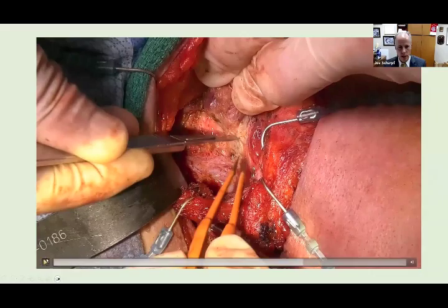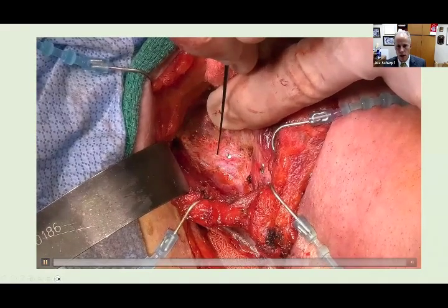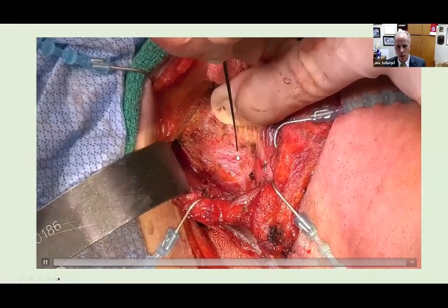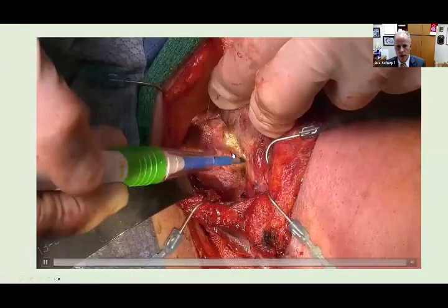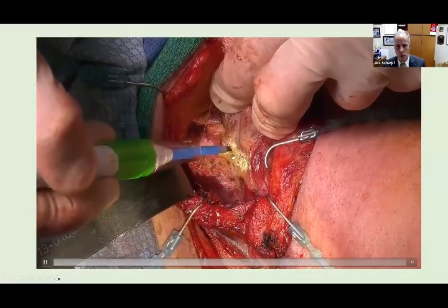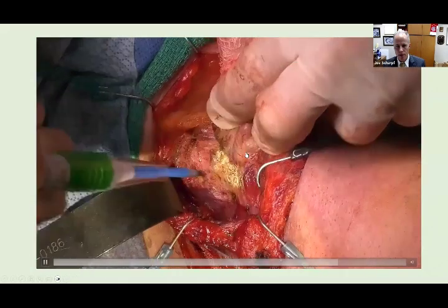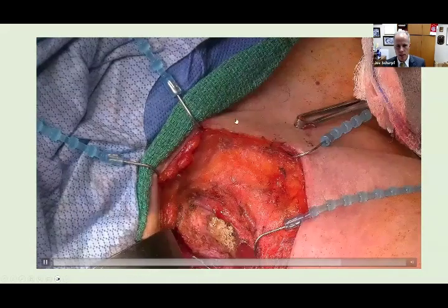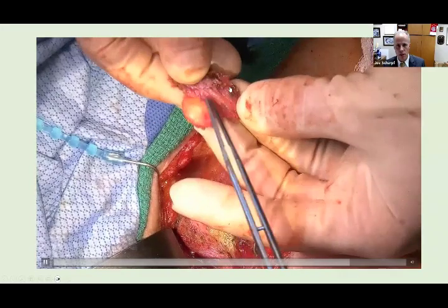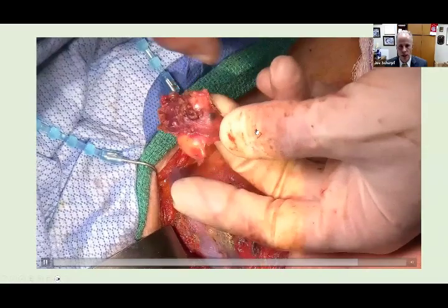So I'll just continue on with the end here of this. As this came up again, no signal on our R1. So I did the V1, which was nothing, and nothing on R1 there. I've gotten the nerve all the way down here. This is where I sometimes will use a bovie to just get it off the trachea. And as I've done this, it's interesting that the giant cancer just went to this little scar ball, but there is still persistent papillary thyroid cancer. So the protocol won't work well with well-differentiated cancer.